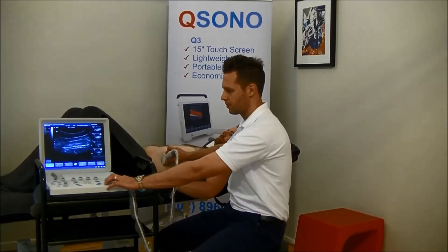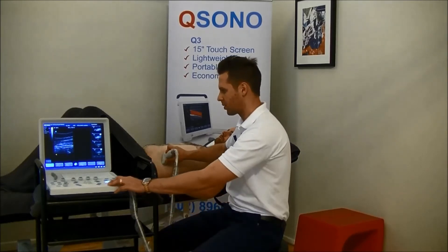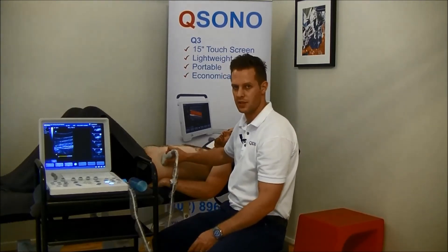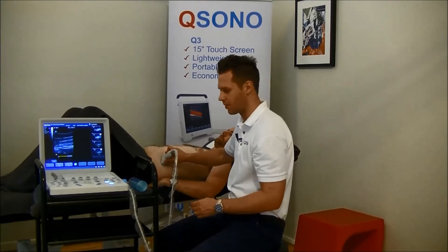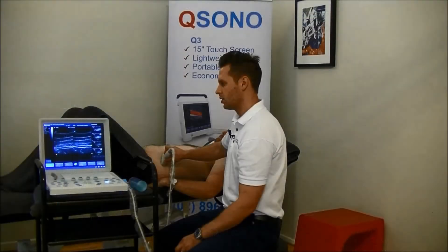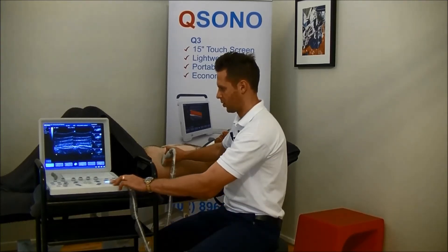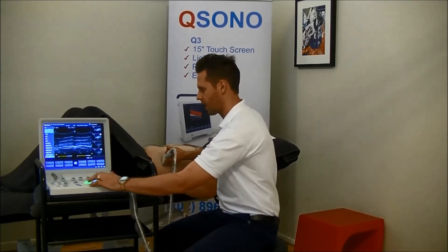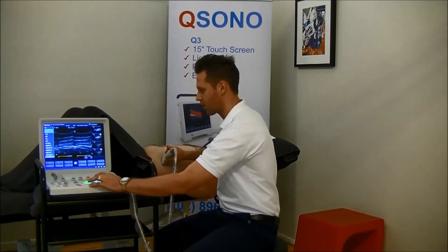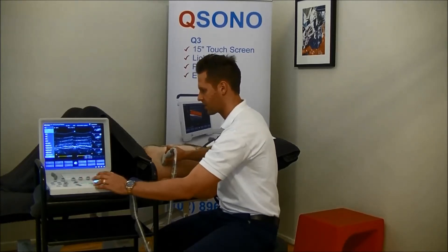Then you can use your split-screen mode to take a picture of the transverse abdominus while it's relaxed. Just take a breath in, and then on the outward breath we're going to freeze the image. We can then use our calipers to measure the thickness. I'm going to have a look at when it's relaxed first to save some time in the measurements. Now I'll get you to contract your transverse abdominus — perfect. So now we're going to measure them and look for the difference. A normal healthy individual should be able to increase the thickness of their transverse abdominus by around 20% with an active contraction. Here I'm just measuring in between the fascia lines so that we're not measuring fascia, just muscle.